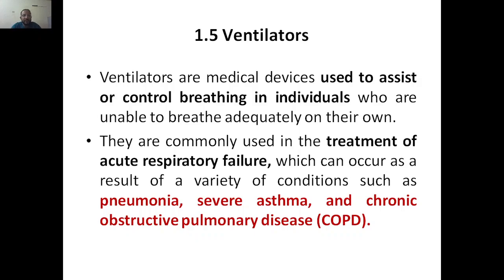So we will see what ventilators are and how important they are to humans whenever your lung collapses or whenever your lung doesn't work. For a short period of time you can't go for medications, because within a short period of time you have to give support to the lung so that it can work. So that's why we need ventilators. Okay, so let's see what ventilators are.